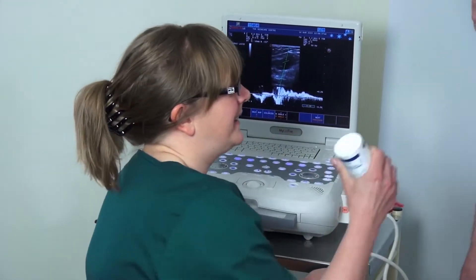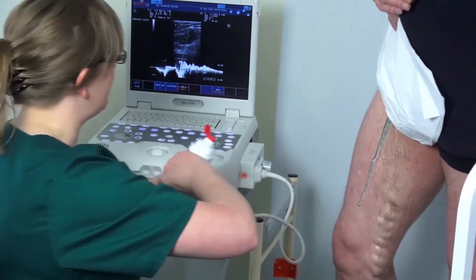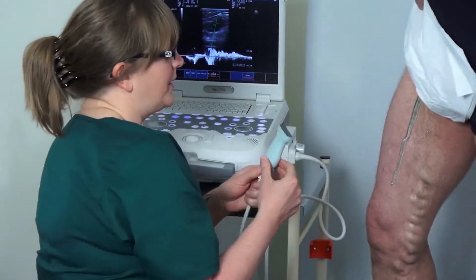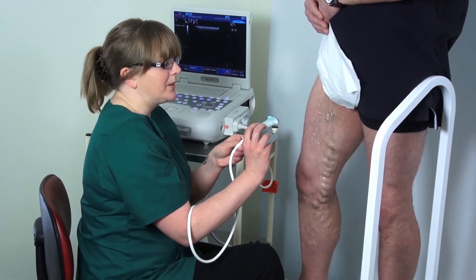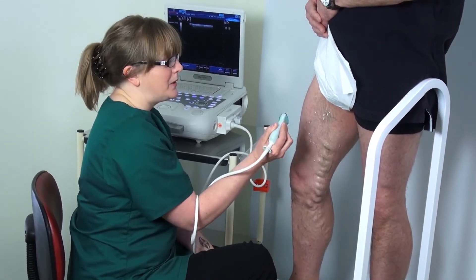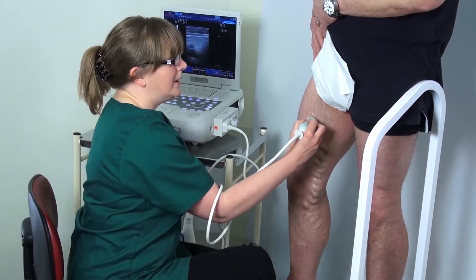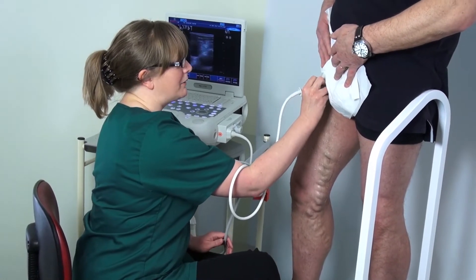Firstly, let's get plenty of jelly on this leg. We always start at the level of the groin crease, and that is where we are going to pick up the deep veins and the junction with the long saphenous vein. To begin the scan, we are going to start using a linear transducer. This enables us to steer our colour flow box, which is much more advantageous than the curvilinear. We are going to start in a transverse position at the level of the groin crease.